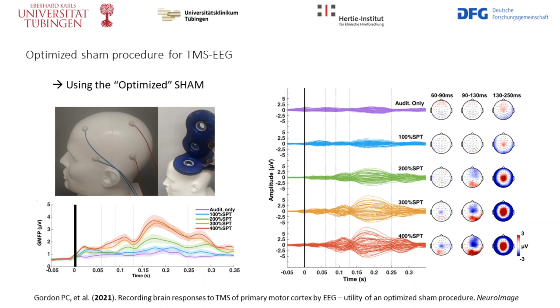So, theoretically, if we use this intensity in both the real and the sham conditions, even if there is an objective difference in the perceptual input, given for instance by the real TMS in the real condition, the resulting difference in neurophysiological responses would not be significant.